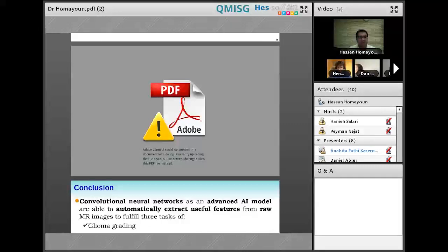Okay, another variation of convolutional neural networks, which is used in the segmentation of glioma, is called U-net, with a U shape. The U-net has two paths of contraction and expansion. If we feed the network with multi-parametric MRI from one side, on the other side, the output is a tumor mask. This U-shaped network can simultaneously take care of both context and localization.